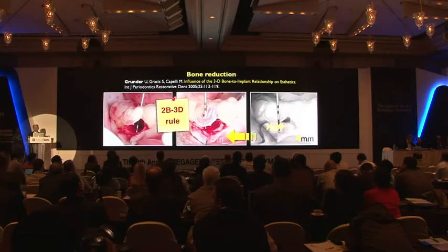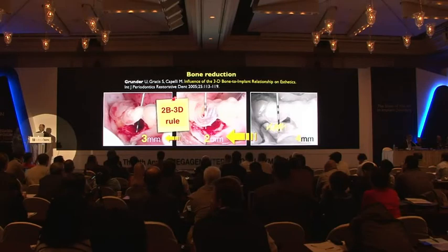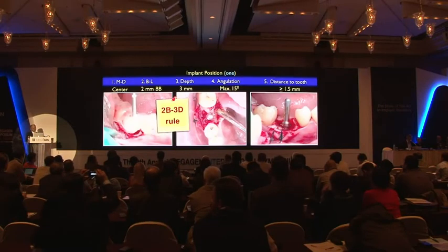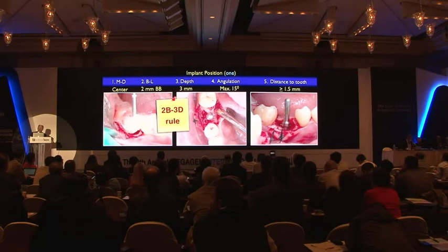And after that, look at that, it will be difficult for people to cut the bone, because in this room we all talk about building the bone, doing bone grafting. So for the implant position, we come up with a guideline like this. For mesial-distal, we put it in the center. Buccal-lingual, we want a 2 millimeter buccal bone thickness.